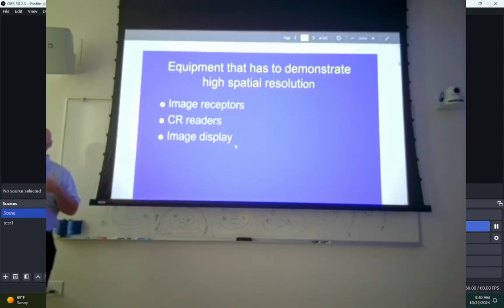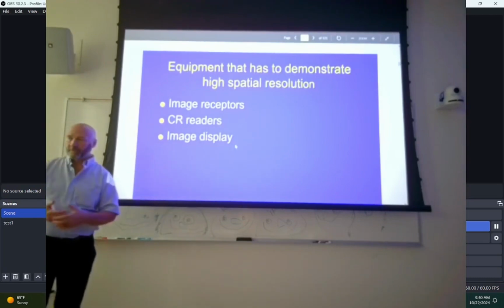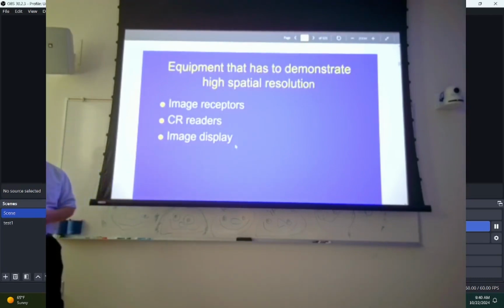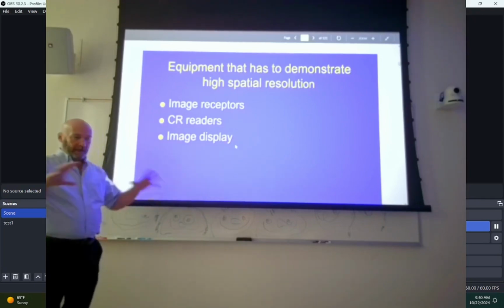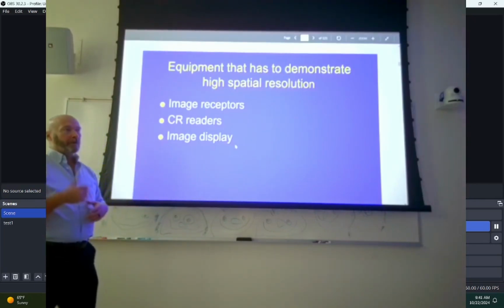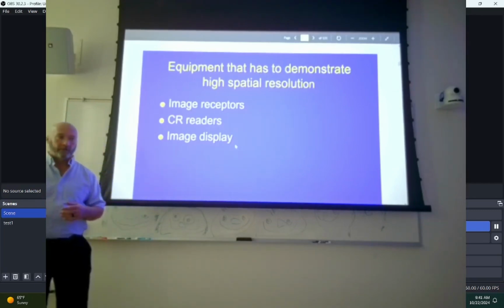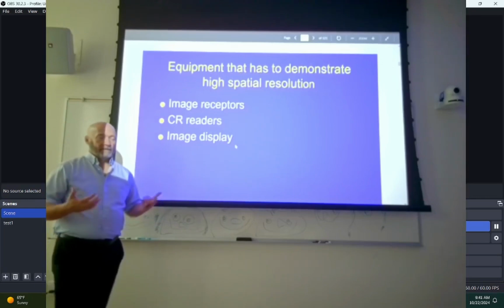So when we started this move into digital radiography, this is where we started, was with CR. And the reason for that is because the transition from screens and films to CR was a lot cheaper than what it was to DR. What we had with screens and films was a standard x-ray room, and you had all these x-ray films, and we had, in most hospitals, all the hospitals I worked in, what we referred to as daylight readers. Or daylight processors.